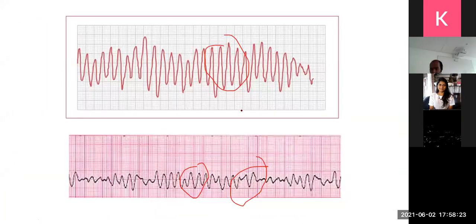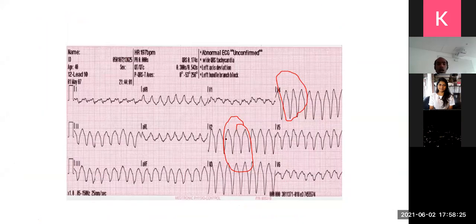So in a ventricular rhythm, then, very abnormal looking QRS complex. When it is like this, it is called ventricular tachycardia. So it's regular in either shape. So this is called monomorphic VT, ventricular tachycardia. Tachycardia because it's fast, obviously, right?